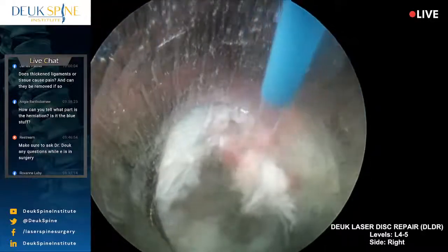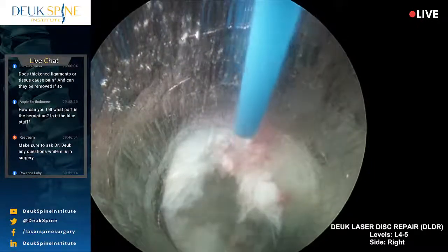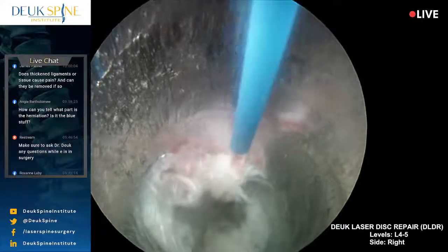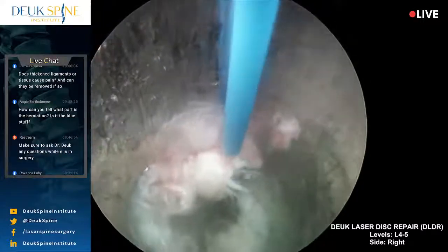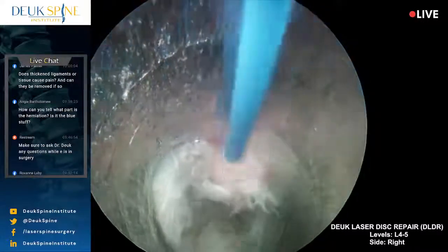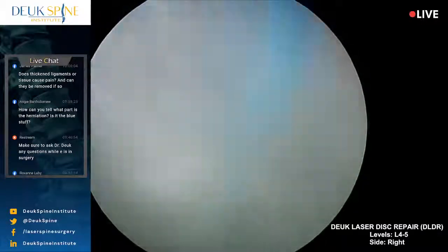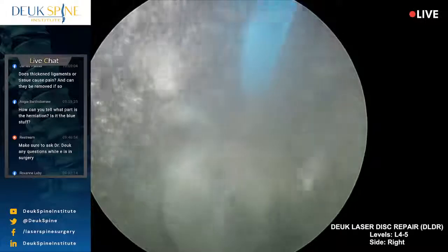By the way, that's the tear right there, in case you were wondering. That's the tear. We've been cleaning the tear from the inside out. We're now close to the surface. I've got 5 minutes left. And you can see some of the pink tissue. That's all inflammation. We have to clean all that stuff out. Why do I have such poor circulation, guys?